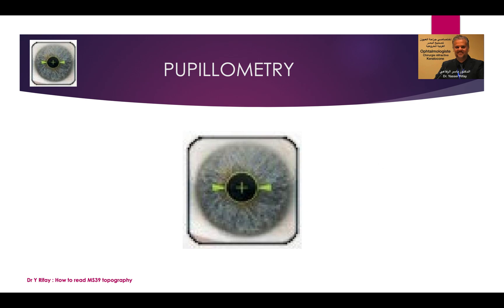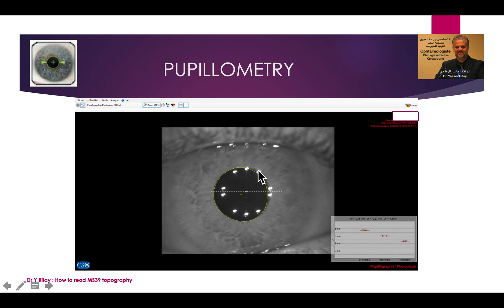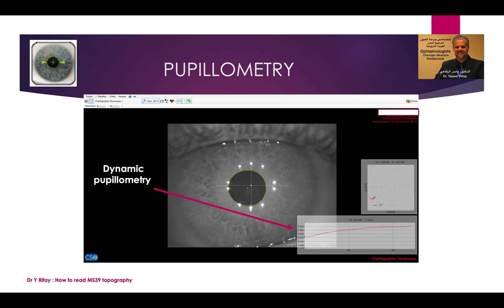You can also use the MS-39 for pupillometry, which is very interesting. You study the pupillometry in scotopic, mesopic, and photopic conditions. For example, the scotopic pupil is 7.5 millimeters and the photopic is 4.62 millimeters. There is also dynamic pupillometry, which calculates the difference and the speed of pupillary movement — the photomotor reflex.